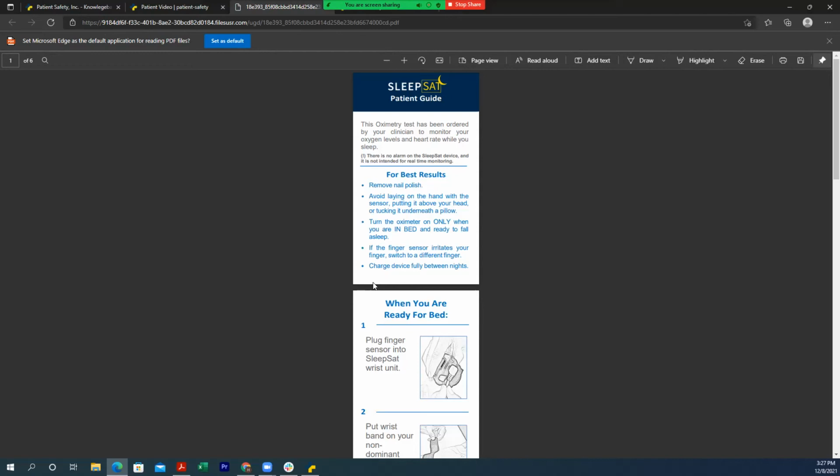And then look at that body of data when the patient brings back the oximeter. Typically, that can vary somewhere between 3 and 5 nights in that situation. The other pretty common protocol that we see does require more visits, but can sometimes be a little bit more comfortable for the patient, is to, again, get a baseline screening when you send the patient home with the device.